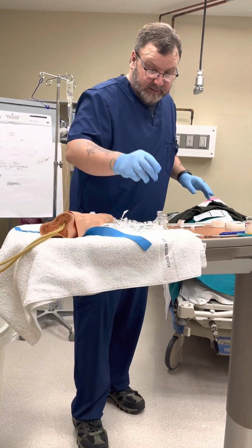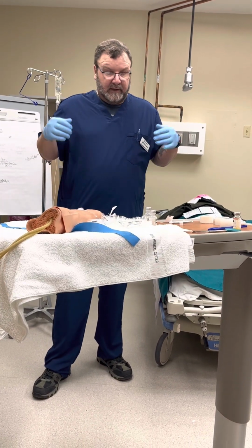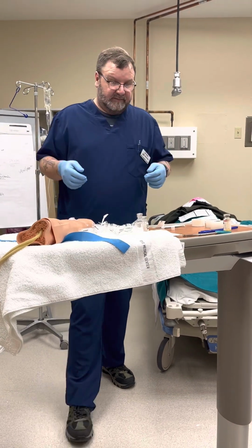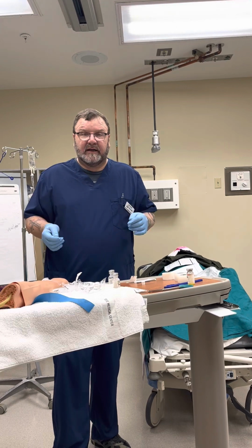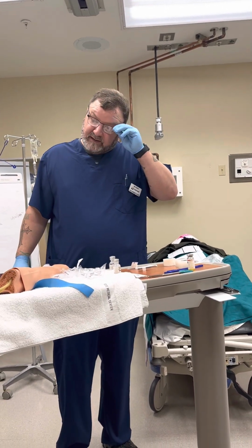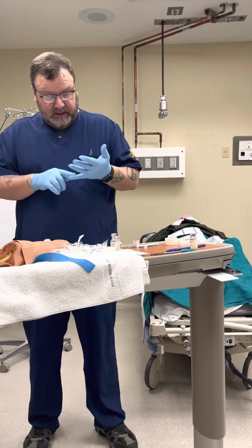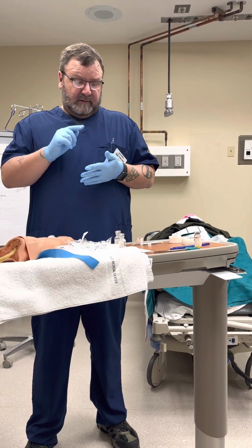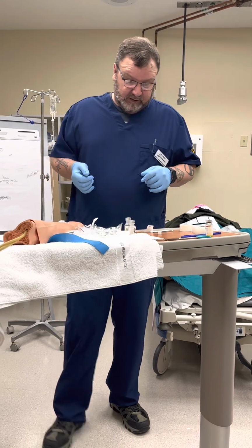Flushed, saline locked. I also have an order. Normally that would be one process, but for expediency, we have an order. This patient is having some pain, so she is to receive Dilaudid per her provider. So again, this is where the 6 rights of medication come in. I'm going to give the right medication to the right patient, the right time, by the right route, with the right dose, and for the right reason with the right documentation.